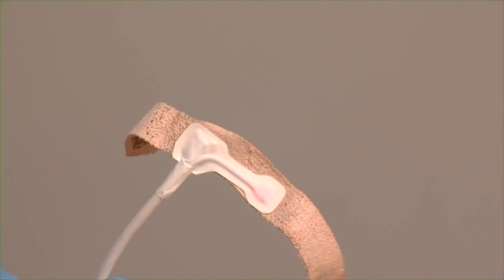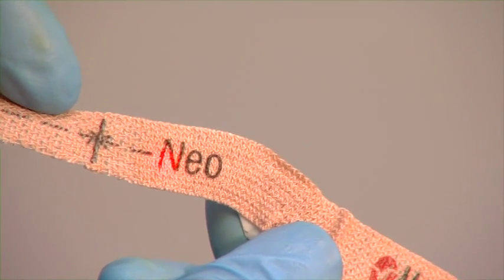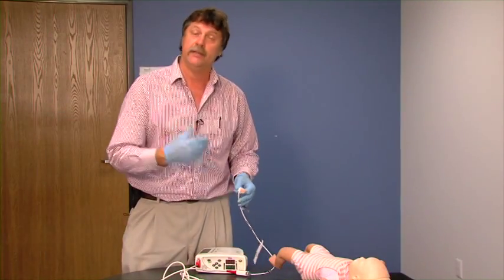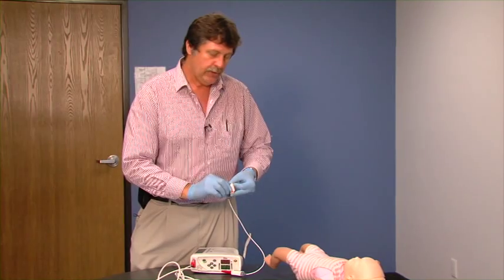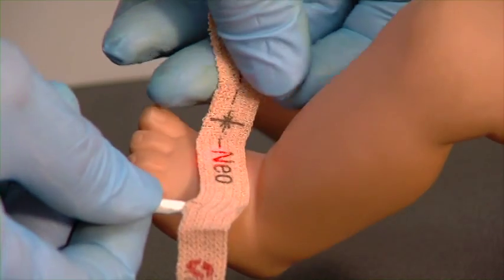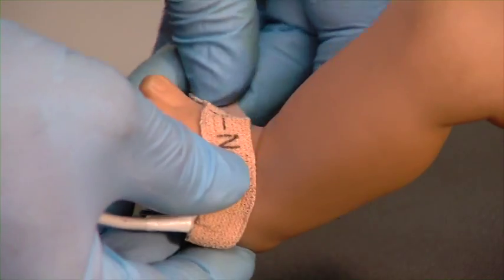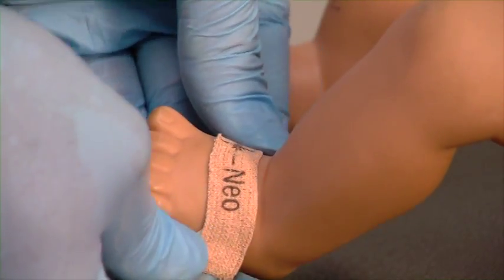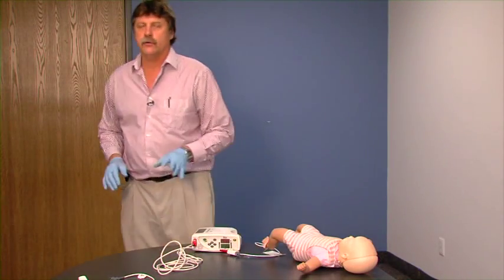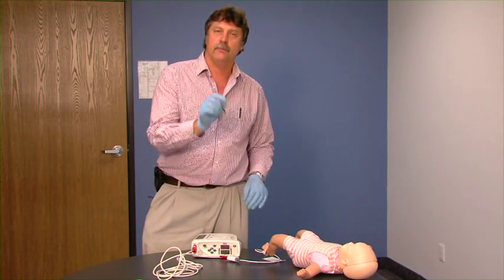The way that the unit works is it sends a pair of infrared pulses through the patient and measures the amount of infrared that is retained or absorbed by the body, and that's going to vary depending on what the blood oxygen level is. We want our light to be on top of the foot, and then we wrap that around. Every four hours, this should be repositioned to prevent skin breakdown from the adhesive.